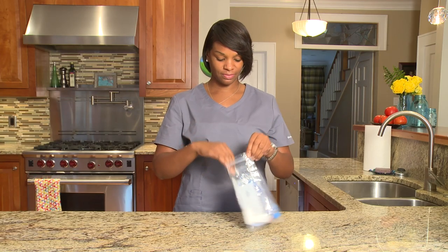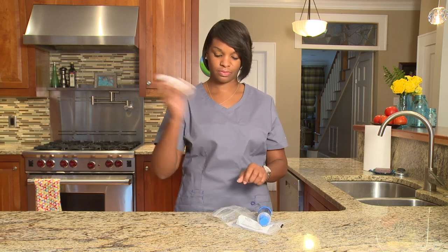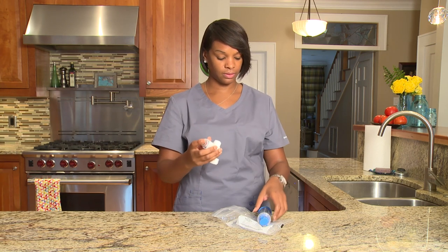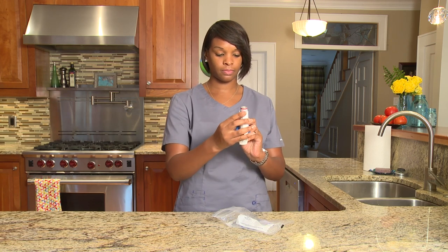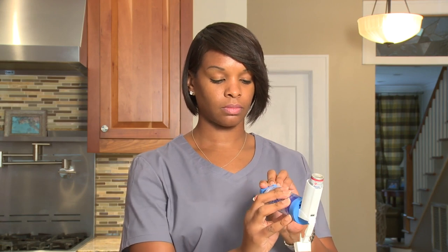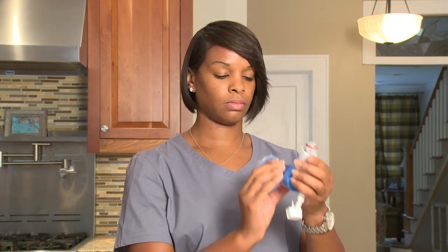Many people have trouble breathing and need to take medicine to help them breathe better. Medicine for your lungs can be taken in several different ways. One way is by metered dose inhaler, also called an MDI. It sprays medicine in a mist form into the lungs. MDIs come in different shapes and sizes but all have the same parts.